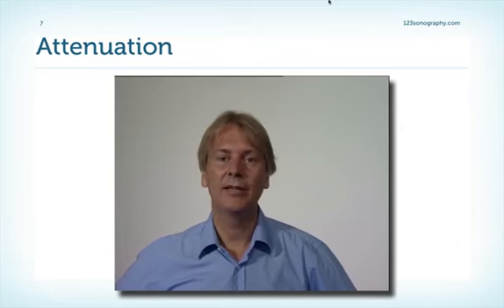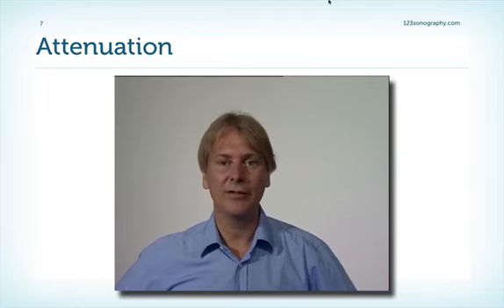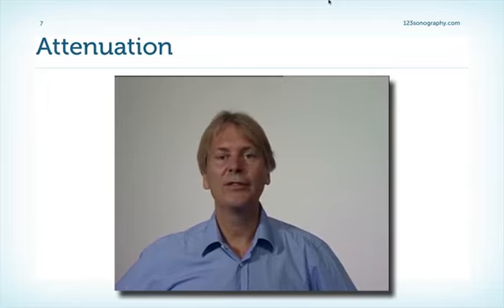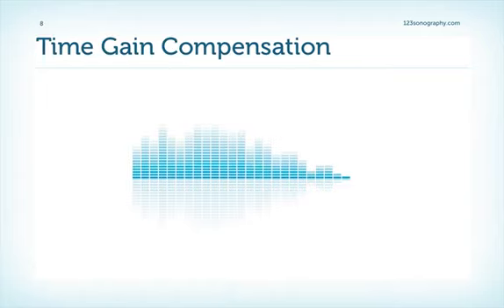Remember, we talked about attenuation and the problem that the ultrasound beam loses energy as it travels into the body. Now, this would result in an image which gets darker and darker the further down we get. Well, there's a solution to that problem. We can use what we call time gain compensation.